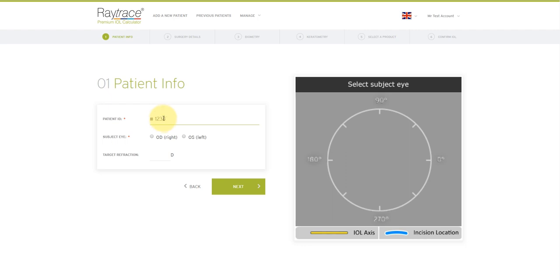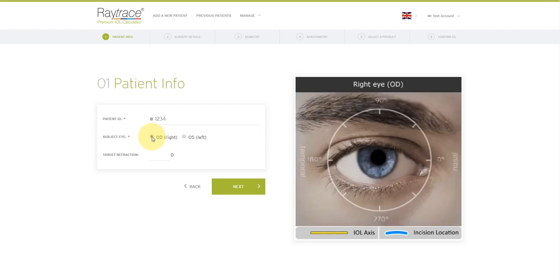I now need to choose the left or right eye for the calculation. Again, this is a mandatory field. And you can also add the target refraction. If you're targeting emetropia, then please type in zero. When you're ready, click next.